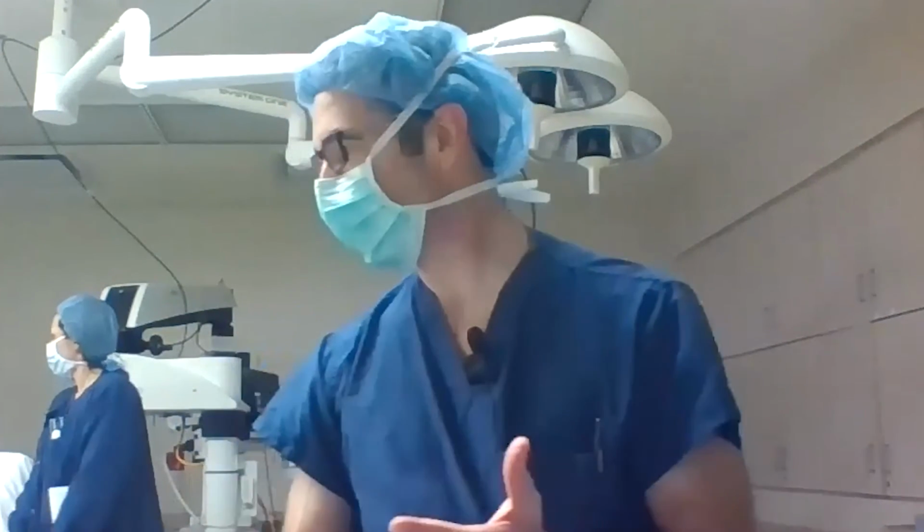Very reproducible. Back to the optic nerve, the fluid drains back very nicely. You're not struggling with residual fluid and possible retinal folds, or concerns about residual fluid leaving your break open. Large gas fill, C3F8 is adequate. I think oil could have been a choice for this case, but the patient looks quite capable of holding his head in the right position, avoiding the second surgery, and the PVR process was very mild. I just don't think the oil is indicated. Scleral buckle would be an option in a case like this too, but we avoided that. So I think we're in good shape.